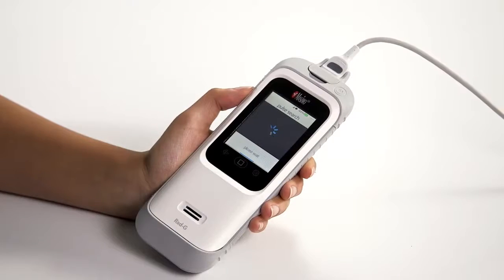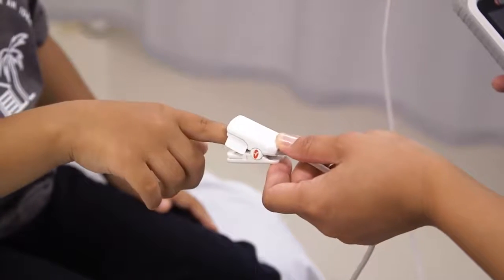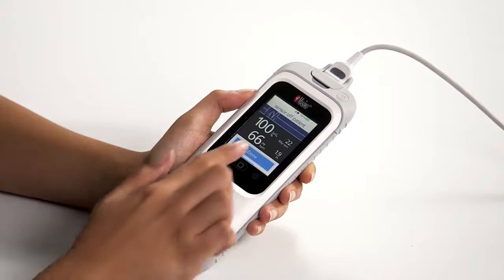RadG will begin searching for a pulse and the display will change to a measuring screen. Once measurements have been obtained, remove the sensor from the patient. RadG will indicate a sensor off patient message. Touch done to return to the mode selection screen.